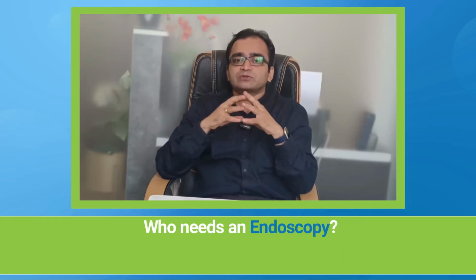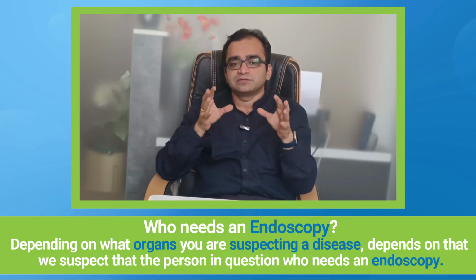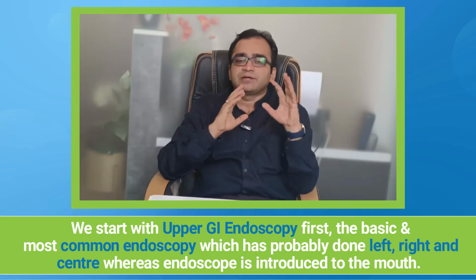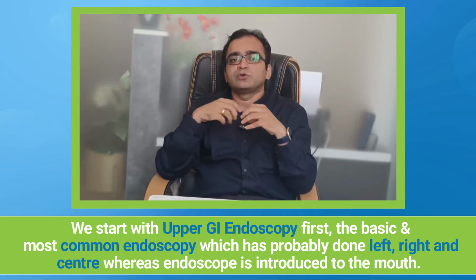Who requires an endoscopy? As I mentioned, depending on what organ you are suspecting a disease in, we suspect that the person, the gentleman or lady in question, would require an endoscopy. So we start with upper GI endoscopy first, the basic and most common endoscope which is probably done left, right and center, where a scope is introduced through the mouth.